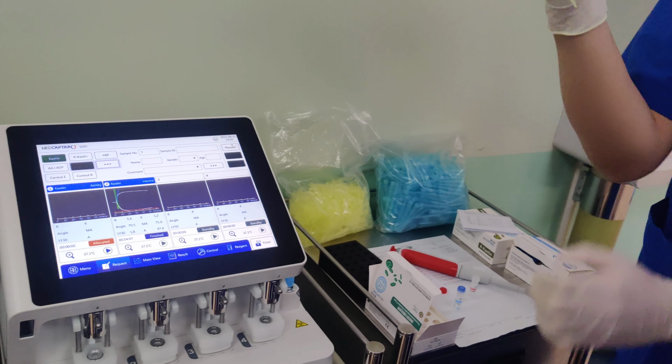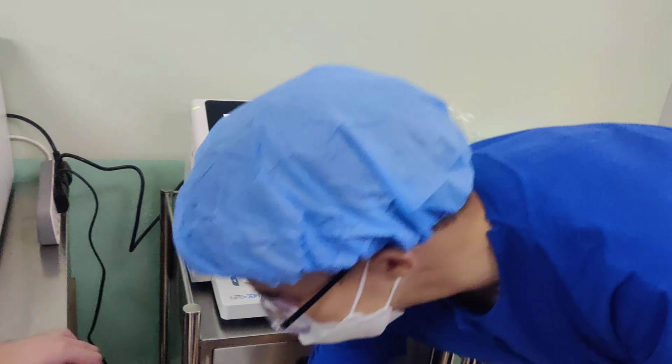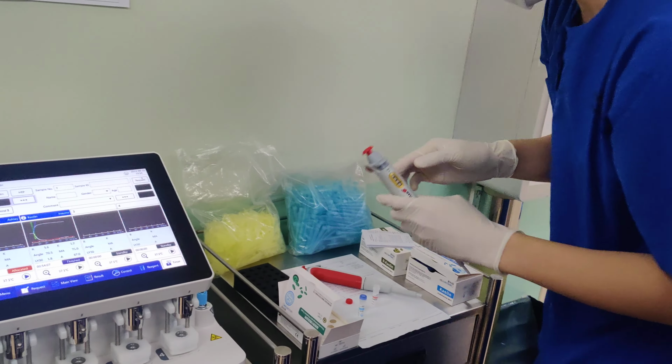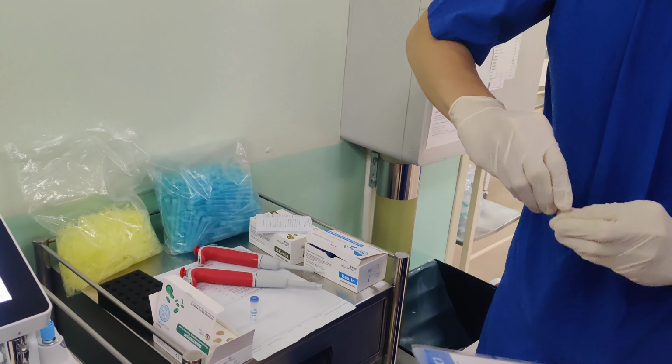Okay, so this one, how to eject after we use? Click this one here. So just eject out. So this thing will have to clean. Okay. Next step will involve the blood already.